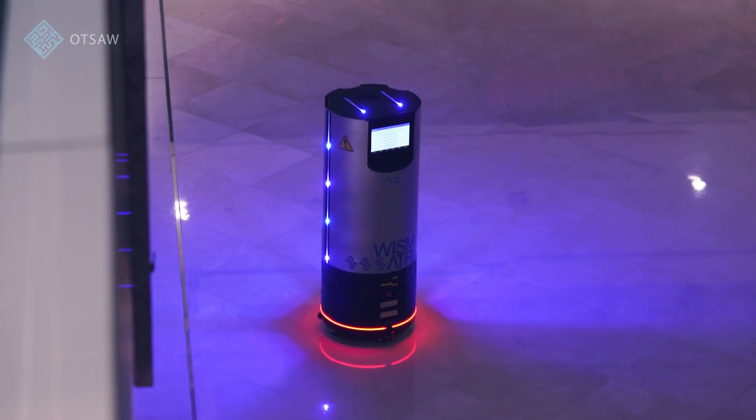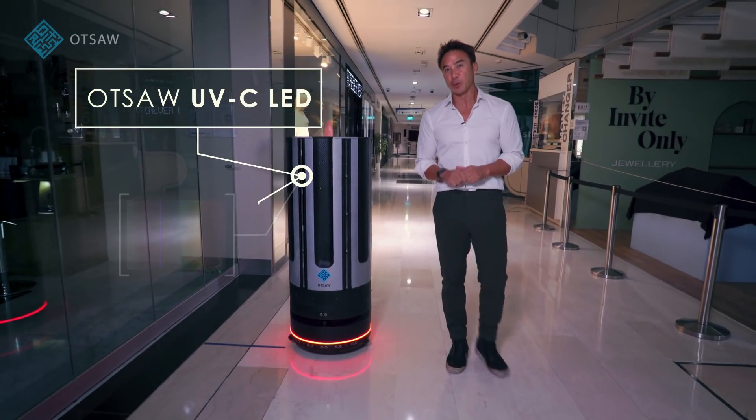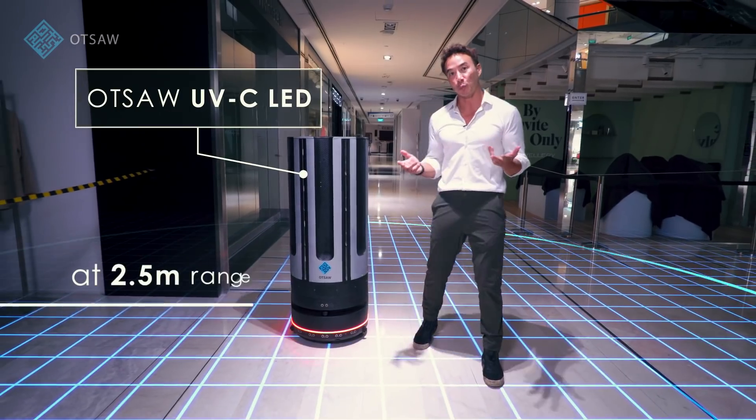But how does it work for disinfection? OTSA's UVC LED emits only a narrow portion of the ultraviolet spectrum, with proven lab results showing 99.99% efficacy within five minutes at a range of 2.5 meters.